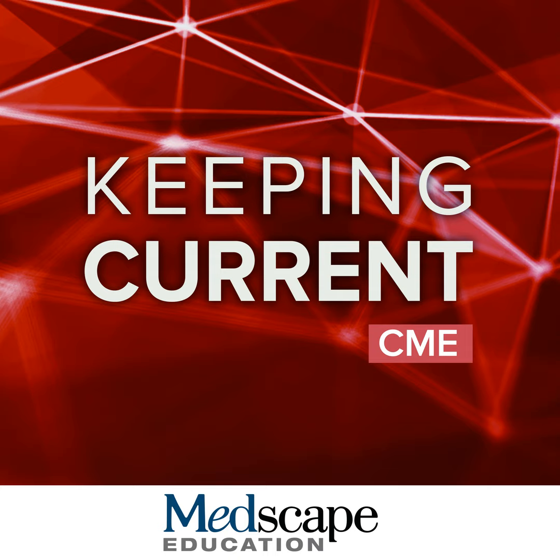Another patient, same thing. This is a neuroendocrine metastasis to the liver. We can see that there's a small sub-centimeter lesion in the right hepatic lobe. You can barely see it, but you can on T2-weighted imaging. On post-contrast imaging, maybe there's some faint enhancement there. And on diffusion, you almost see nothing. But this, too, was a path-proven neuroendocrine met to the liver.